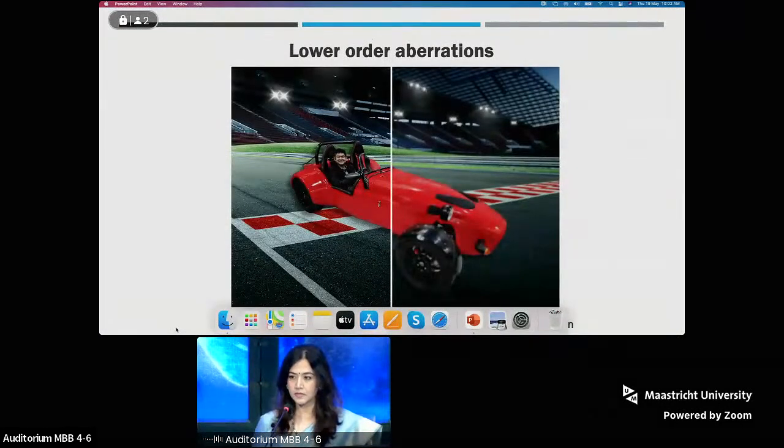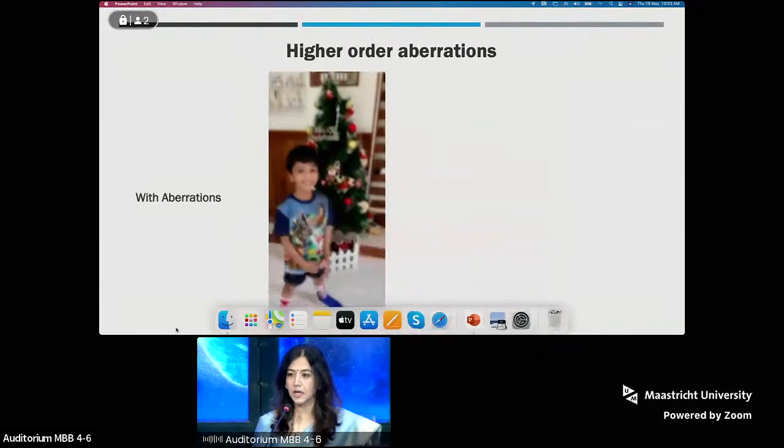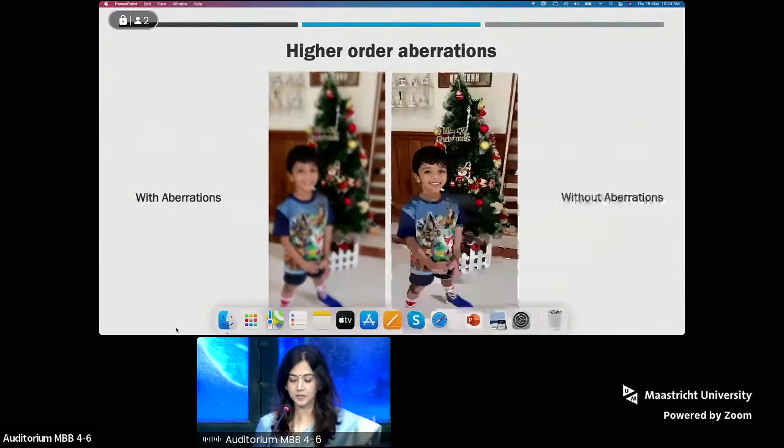The human eye is not an optically perfect system, and there are irregularities within the tear film, the cornea, the lens, and the vitreous, making visualization of the retina very difficult. Lower order aberrations constitute the greatest proportion and can be corrected by these machines. Higher order aberrations limit the lateral resolution capability by causing considerable distortions to the retinal image, as part of the light is transmitted through the marginal areas of the pupil away from the optical axis.